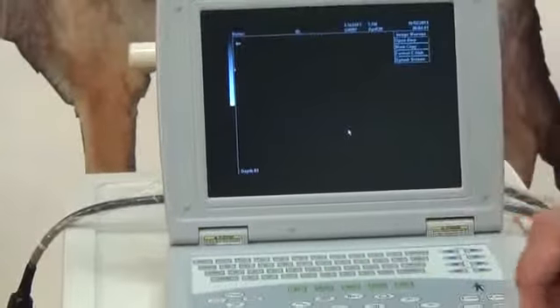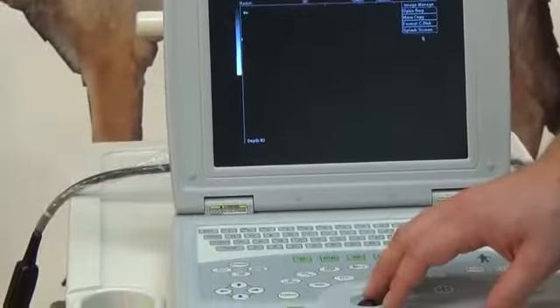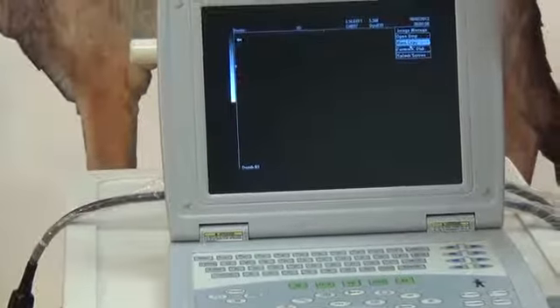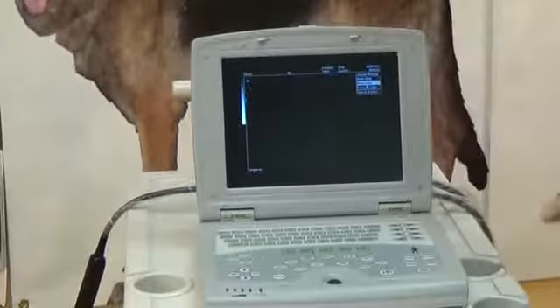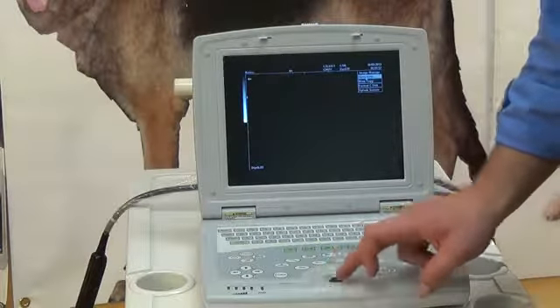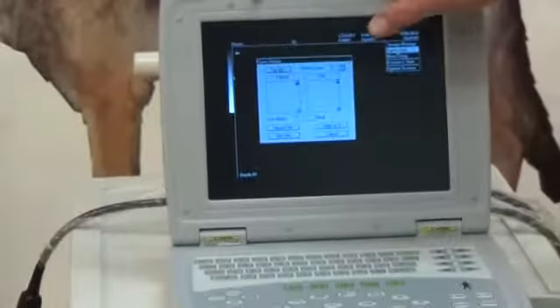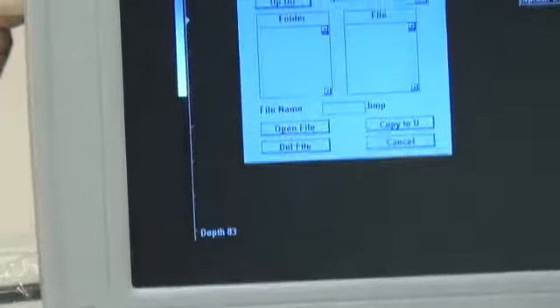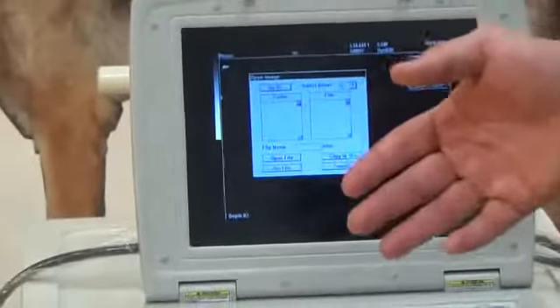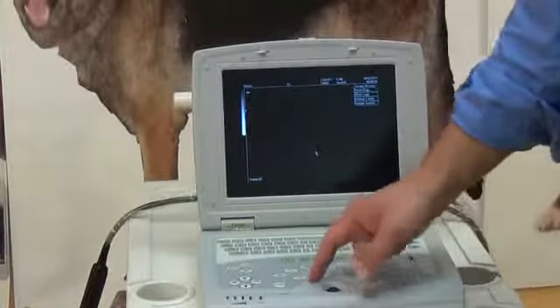We have the store recall button. When you hit that, you get 4 things that come up. And you use this if you don't have your USB set for automatic transfer. So if you're doing this, the mass copy will just dump everything onto the computer, onto your USB. If you open it, that's the top button here, you can select from your C drive, which is the computer, to like an A drive, which is a USB, and save, delete, or copy from the computer to the USB and vice versa. So it's pretty self-explanatory. It's not that challenging to get that going.